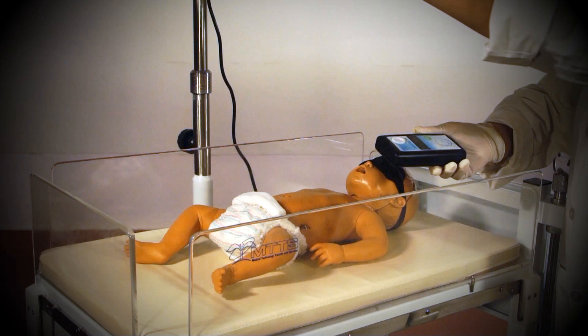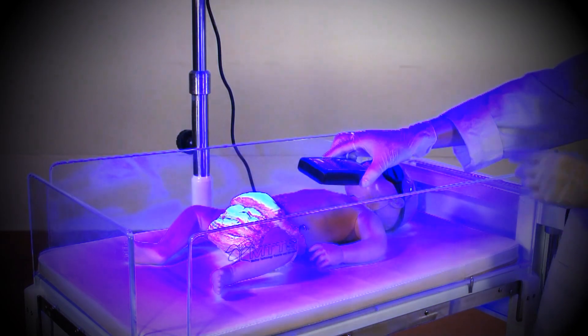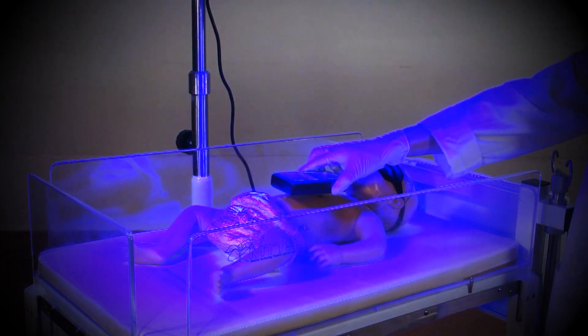To determine the intensity of the treatment the baby is actually receiving, hold the light meter directly under the light at the same height as the infant. This will indicate the actual amount of light reaching the patient's skin.